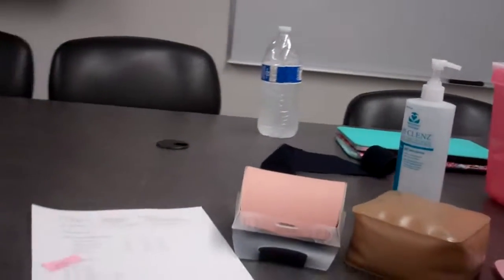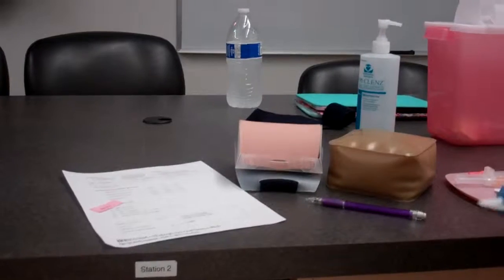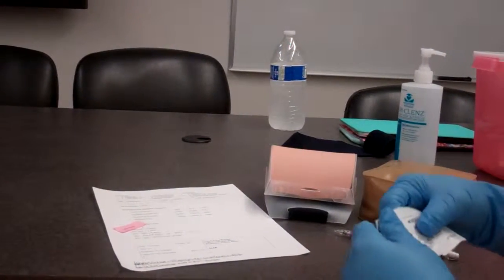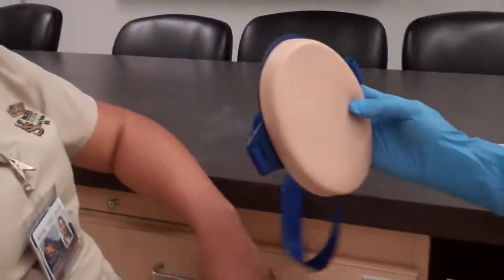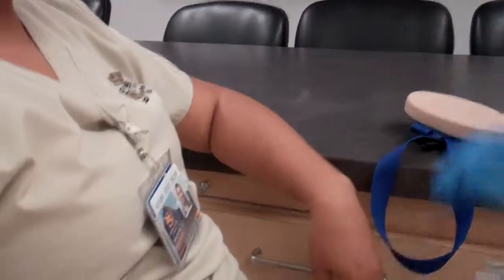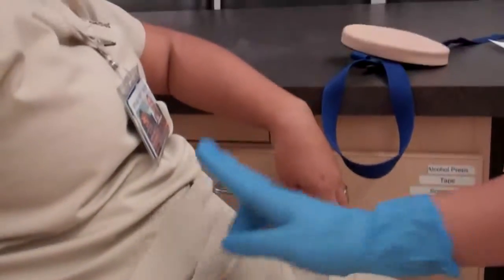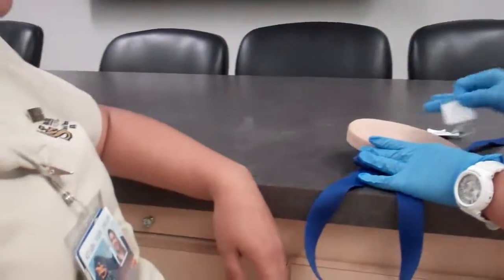So for your insulin, where was the last place that you had it? I had it in my belly. Your belly, which side, left or right? I had it in my left side. Left side? Awesome. Okay. So today I'm going to be doing the right side of your stomach. I'm going to make sure it's 2 inches away from the umbilicus.